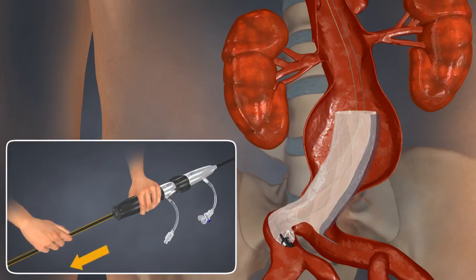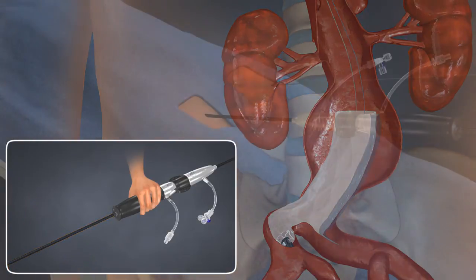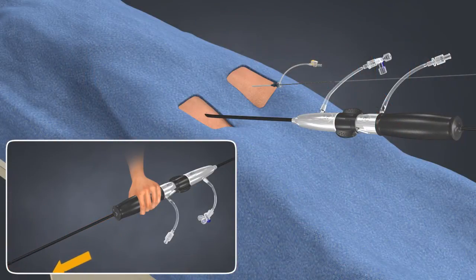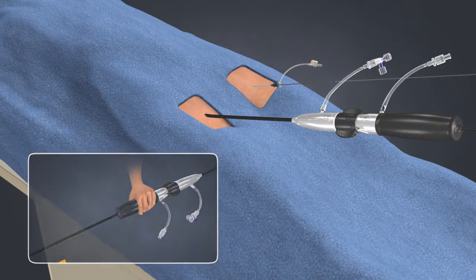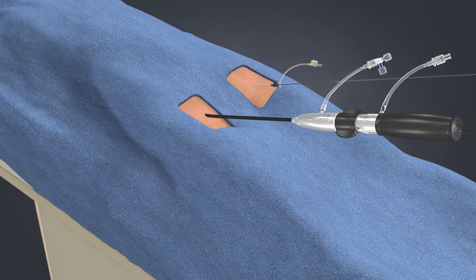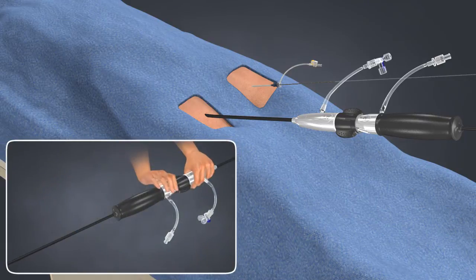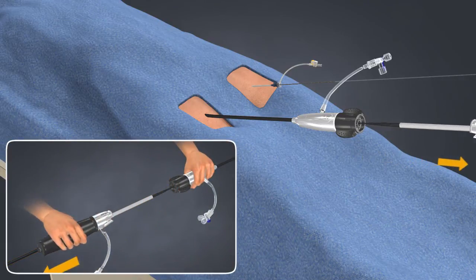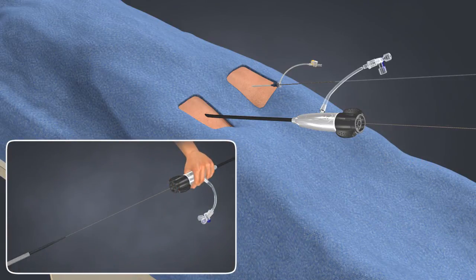While continuing to pin the delivery system handle, pull back on the inner core until it stops. Release the bifurcated delivery system and then retract.